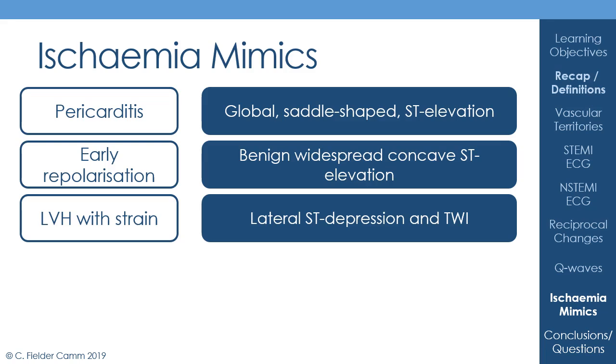And I think that's part of what you should be looking for, is whether these changes are occurring over time or whether they're fixed. If it's left bundle branch block causing ST elevation, then if you do the ECG now and you do it in half an hour, 2 hours, it should be very similar. Whereas if you've got something that's evolving, like a myocardial infarction, then you're going to get changes in those ST segments, changes in those T waves. And the reason to put LVH here as well is simply because you can get quite some dynamic change if the patient's unwell with it.